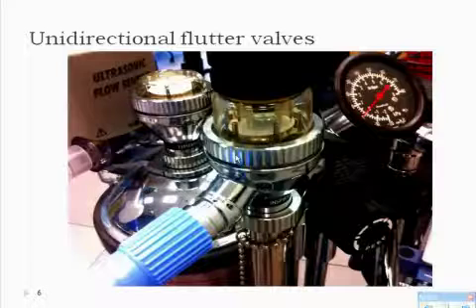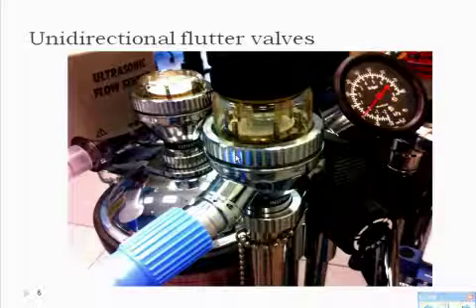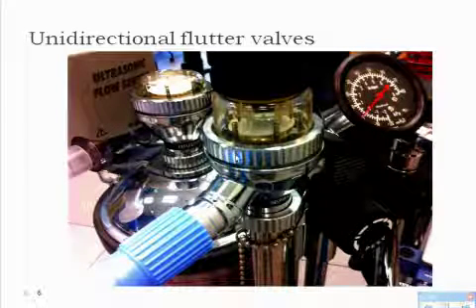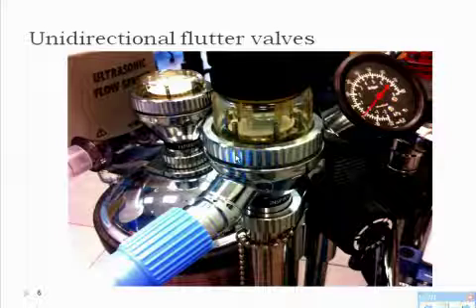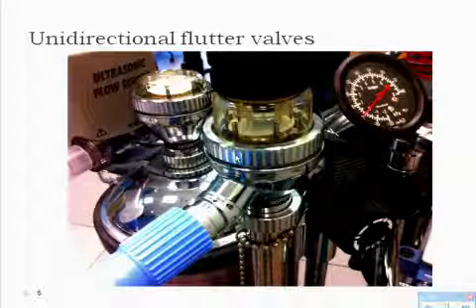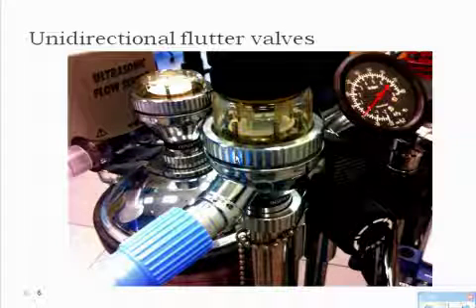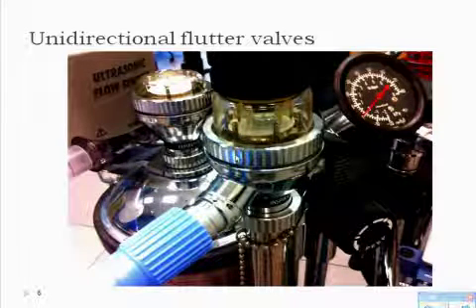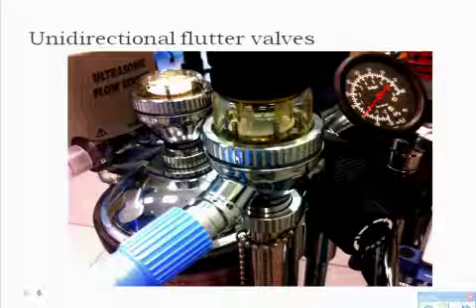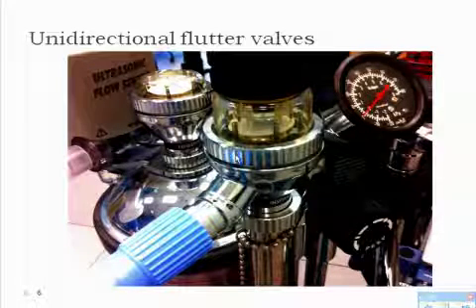Okay, and if we talk about unidirectional flutter valves at all, they're always unidirectional. All right? If they were bidirectional, then that means they're broken. If you go to perform an anesthesia machine check, you squeeze on the bag, and you don't get your expected result, you always look at your valves. These things can crack, like I said.